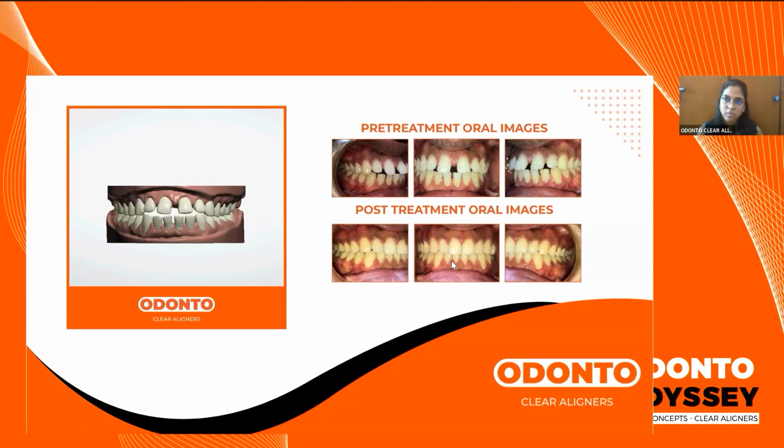These can be aesthetic ones which can be provided to you, or the metal buttons can also be placed if they are posterior teeth. If they are even on your first premolars and you want derotation to take place, then we can give aesthetic buttons for the same, so that even when smiling, the first premolar is visible, but the button will not be as prominent as a metal button which is placed.